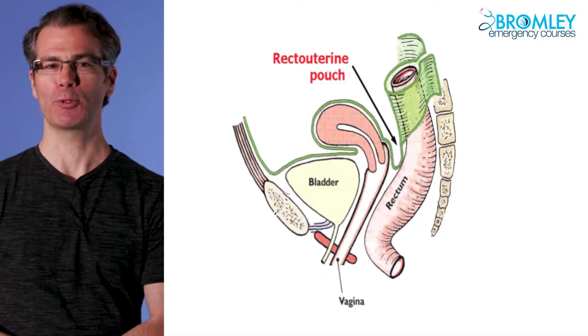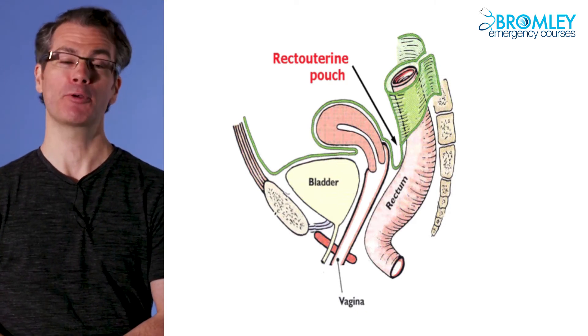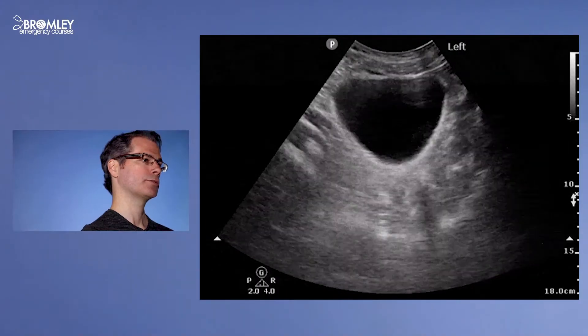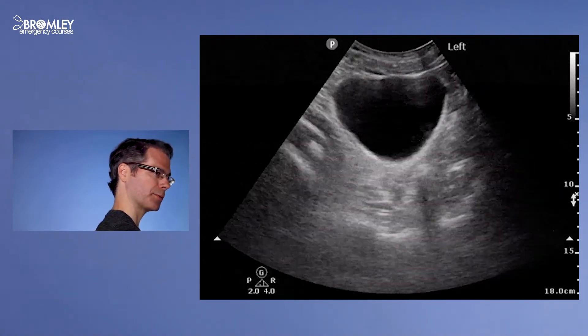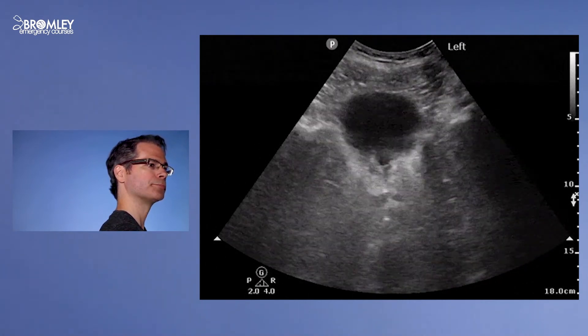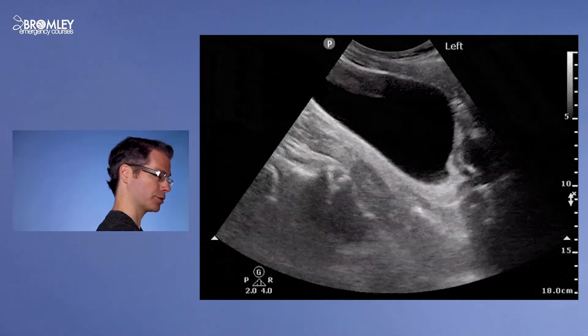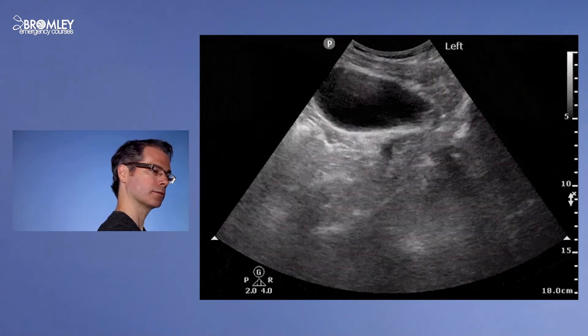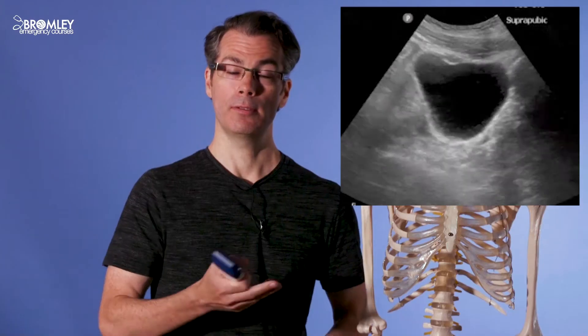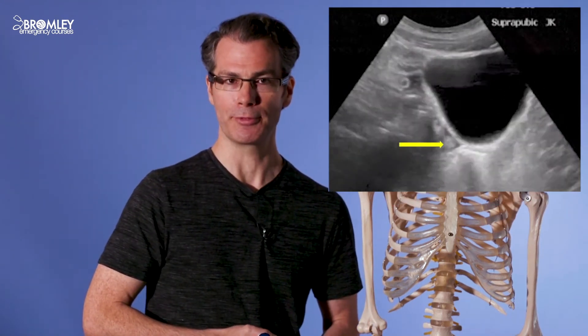In the pelvis, fluid tends to accumulate in the recto-uterine pouch in females, also known as the pouch of Douglas, or the recto-vesicle pouch in men. Here's an image of a normal pelvis in the transverse plane, fanning through from superior to inferior. Here's a video of a normal pelvis in the sagittal plane, fanning laterally. In this image we can see there is a small amount of free fluid, and again here in the sagittal plane, we can also see a small amount of free fluid.